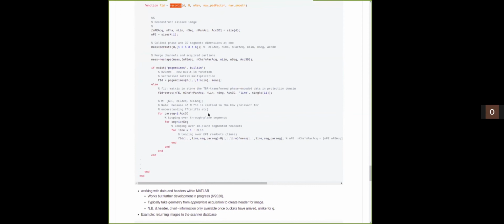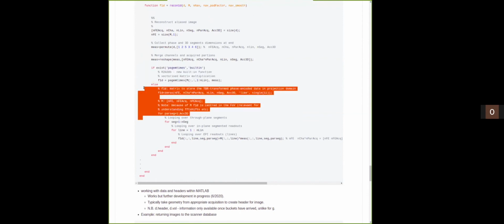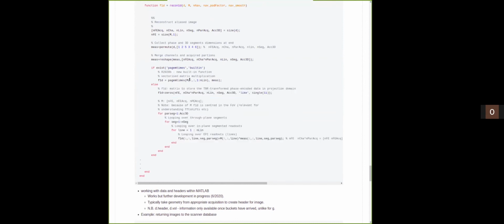Little tip for the future, 2020B has a built-in function that basically does that very fast. So it does matrix multiplication on the first 2 dimensions of the arguments, vectorized over all subsequent dimensions of the input functions and with appropriate singleton expansion.